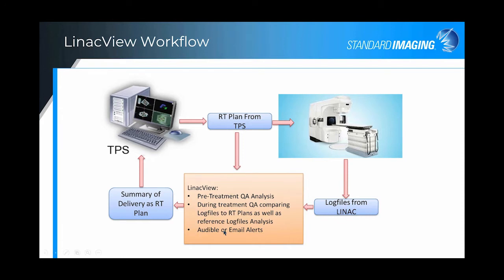And then as well, LinacView has internal templates that will produce audible or email alerts based on the tolerances that you have set up for your individual clinic. And then if it's one of those rare cases where you do get one of those email alerts, there are all kinds of tools that I will try to show you as we go forward. You'll get audible or email alerts as you have it set up, and you can receive both or either.